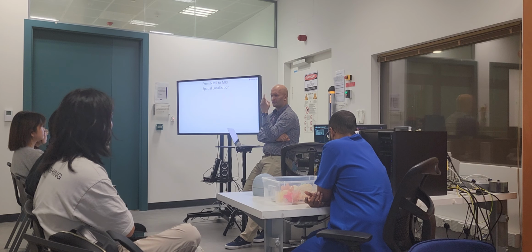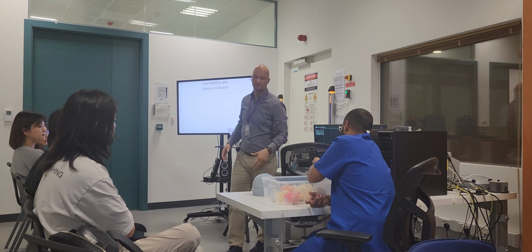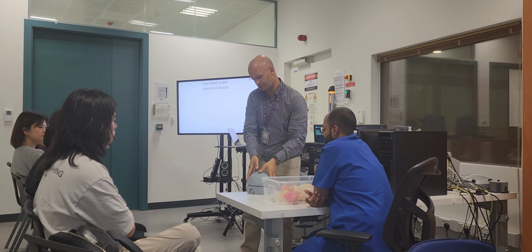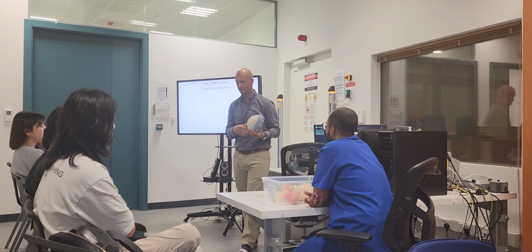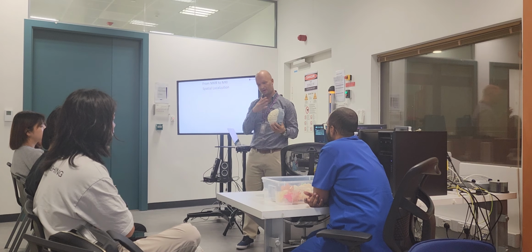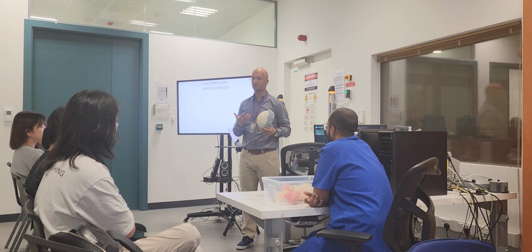Sorry. Okay. The problem with this is if I put the head here, this is actually our colleague, she's a postdoc at NYU. If I put her head in an NMR machine, 500, it doesn't fit, let's say it fits. And I do an NMR experiment, I will get a single FID and a spectrum from the whole head. What's missing with NMR? Spatial localization.